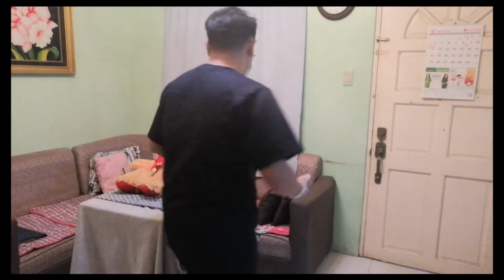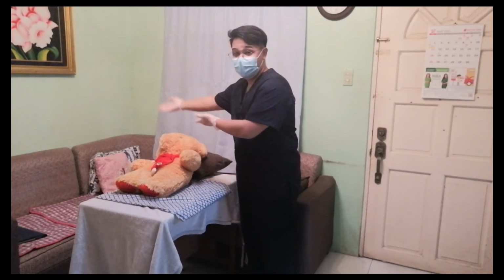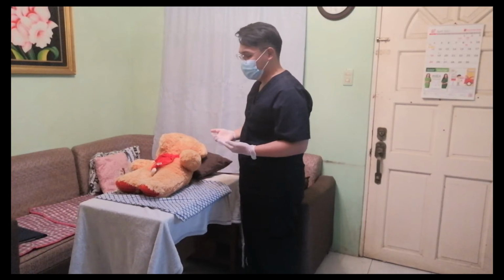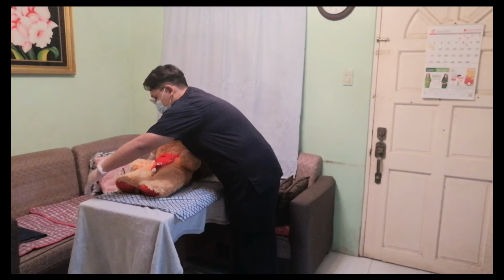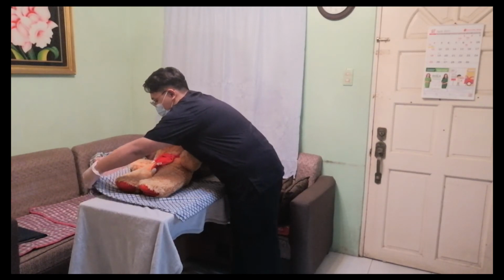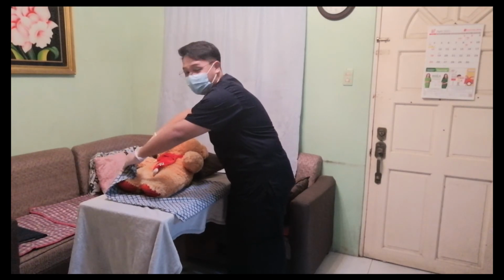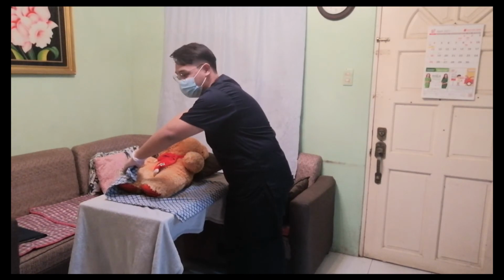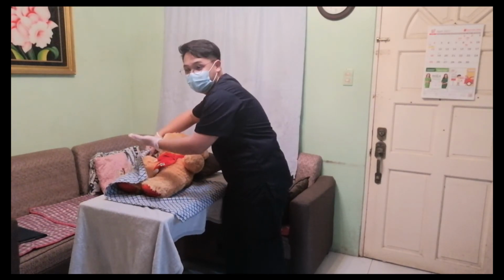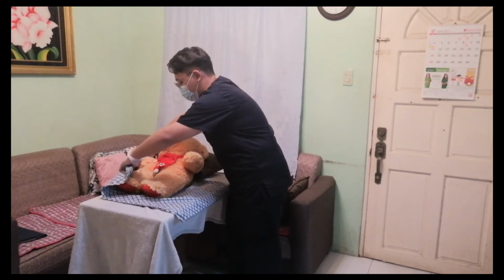So let me go on the other side. So let us assume that the other nurse is on the other side of the bed, and I will be using the friction reducing sheet. So here. Okay ma'am, ito turn ko na po kayo. Now we will be turning the patient on our side. So the nurse on the other side will help me push the patient towards my side. Okay, ma'am. 1, 2, 3.